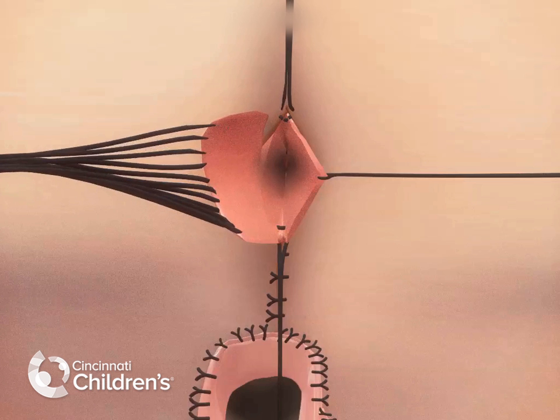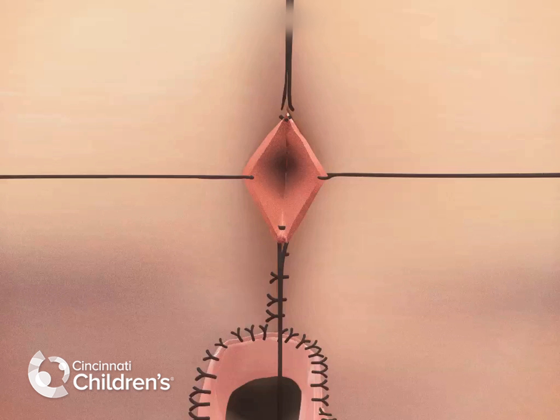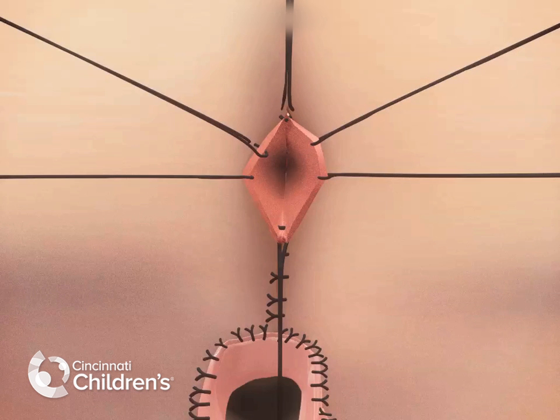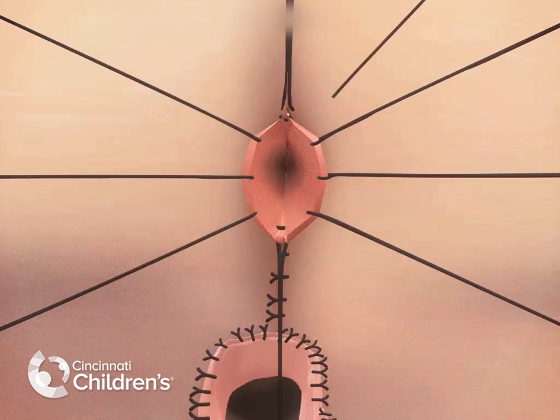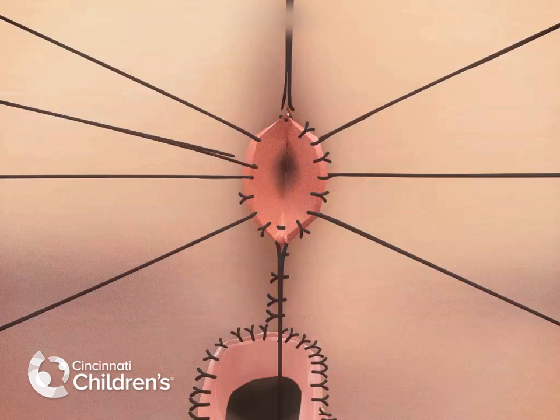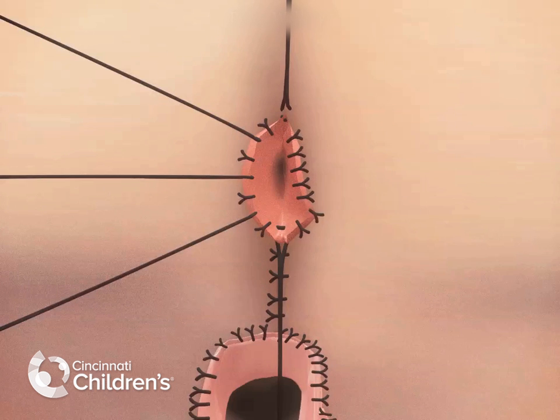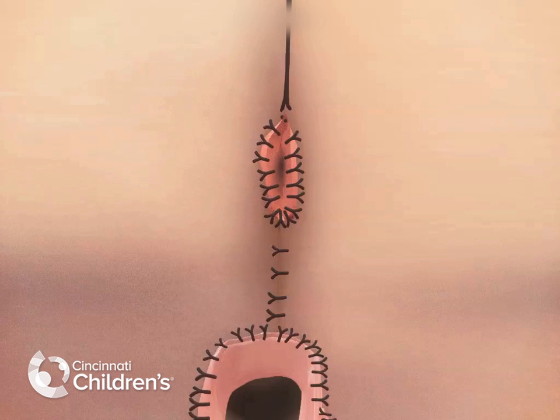And the remainder of the anoplasty is completed with multiple long-term absorbable sutures, evenly spaced circumferentially around the rectum. As the sutures are cut, the anus retracts into its position in the gluteal cleft, completing the operation.